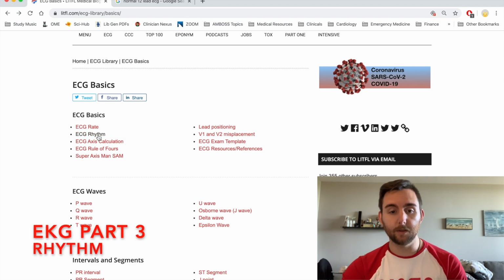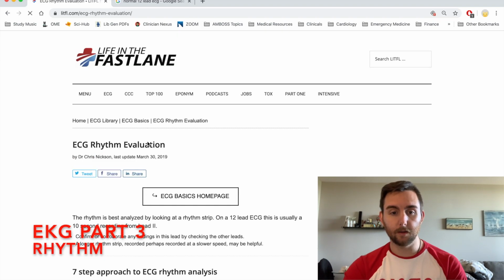All right, so next we're gonna go into rhythm. You click ECG rhythm here on this website. Okay, so we've talked about rate. I said there's normal, there's fast, there's slow, there's very fast, and there's very slow. Rhythm is kind of the same thing.